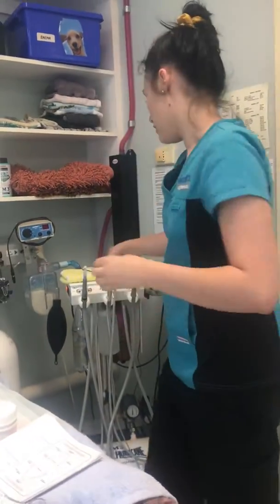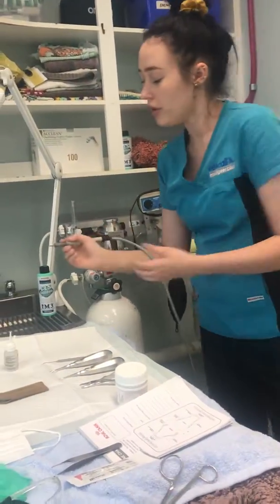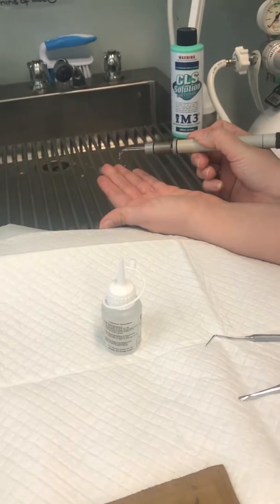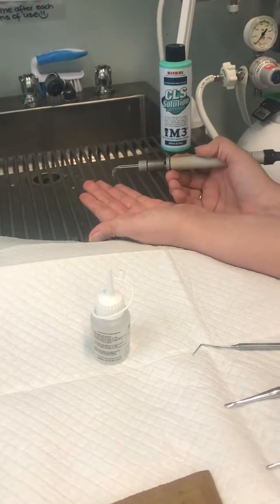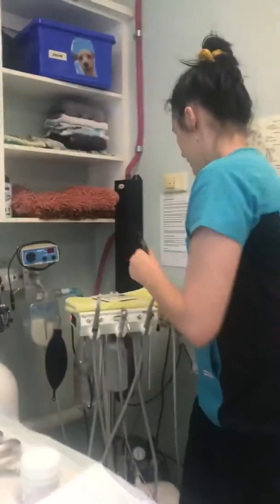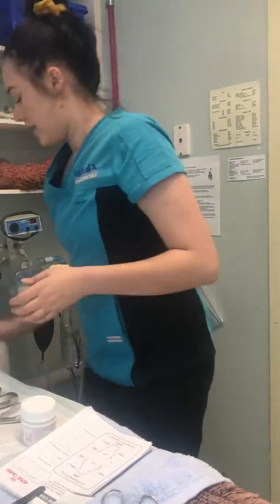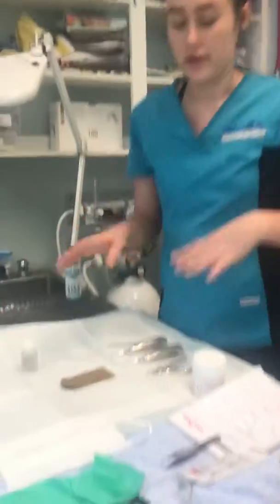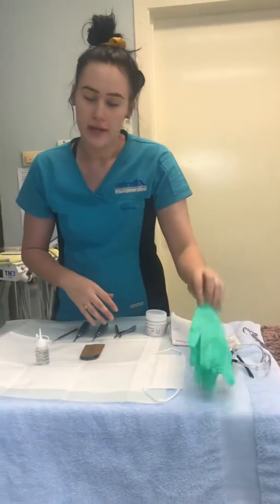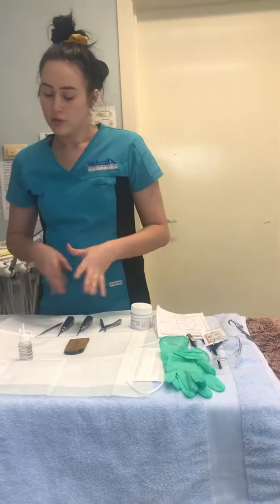Also too, with your ultrasonic scaling machine, you just want to make sure that it's got enough water flow. So just turn it on there and just make sure there's enough water coming out of there. The more the better, just so you don't heat up that tooth and heat up the pulp and obviously create a dead tooth. So once all of that is done, you just want to make sure that you've got everything that you require for your dental extraction, including PPE, gloves, goggles and mask, and then also your dental instruments.